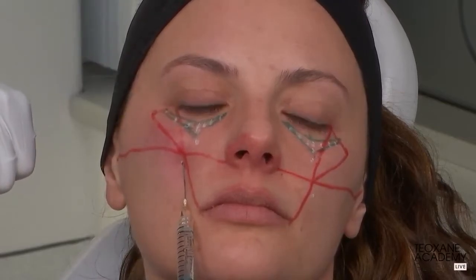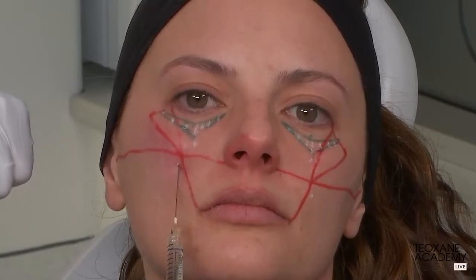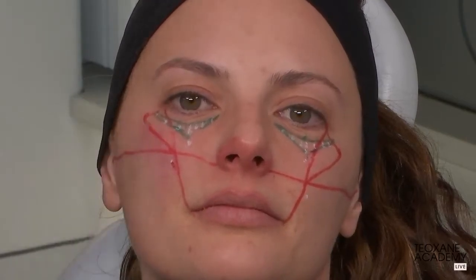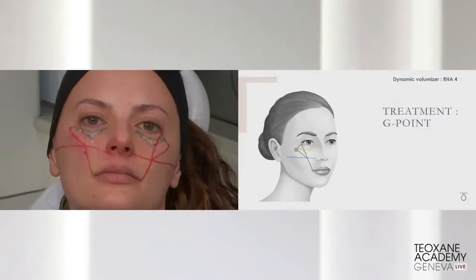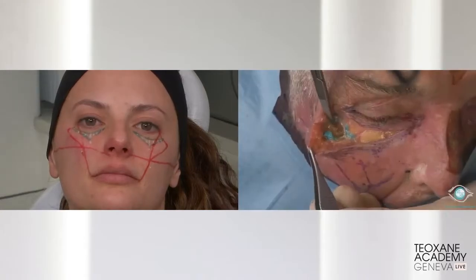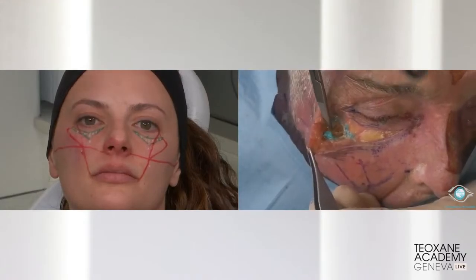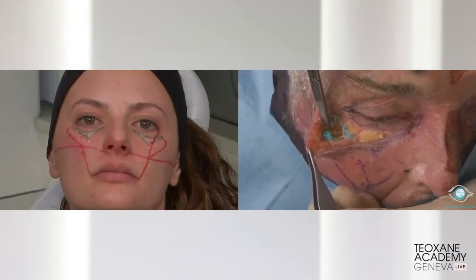So I'm in a space that actually I prepared something for you. Because I knew from an anatomist such as you are, I want to show, if it is possible, to play on a split screen the anatomic point at the G point. Exactly, thank you very much. At this point, if you want to look under the tissues, you want to know where this filler is being placed, you can play the video now. Here you see my RHA4 being injected at the G point. There you are, right at the G point, deep to the lateral SOOF, right on top of the bone.